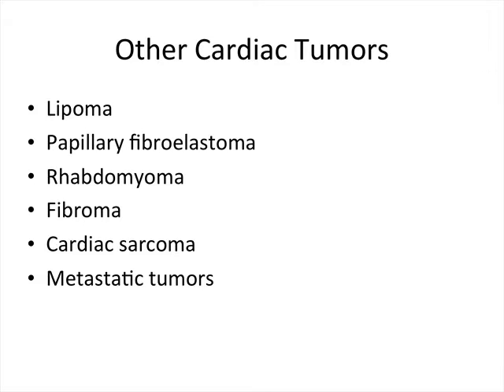Cardiac sarcomas are malignant cardiac tumors found in ventricular myocardial tissue. They can become quite large and protrude into the ventricular cavity and surrounding structures. There is extensive vascularity with malignant cardiac tumors. Ultrasound and TEE are useful to visualize this increased vascularity associated with cardiac sarcomas. Metastatic tumors that involve the heart can do so through local invasion or hematogenous extension.